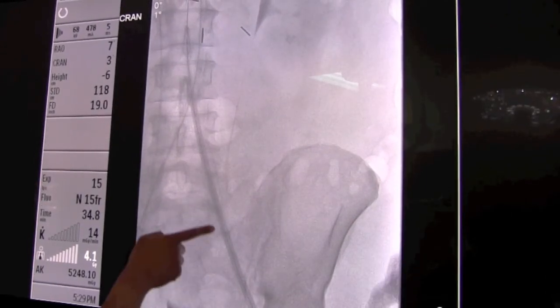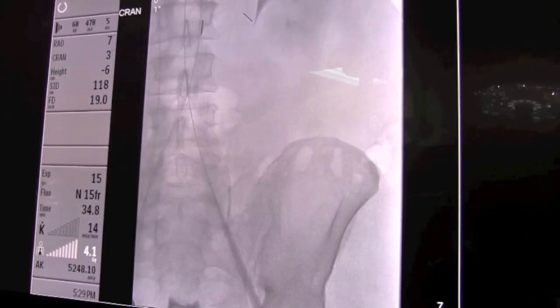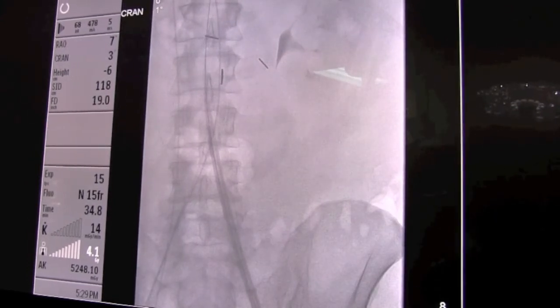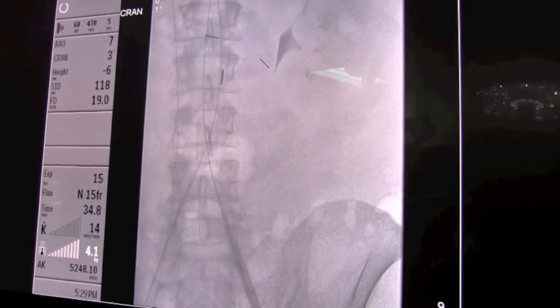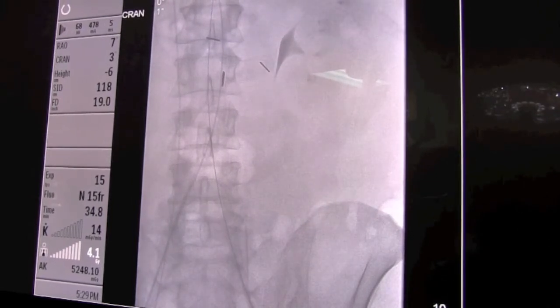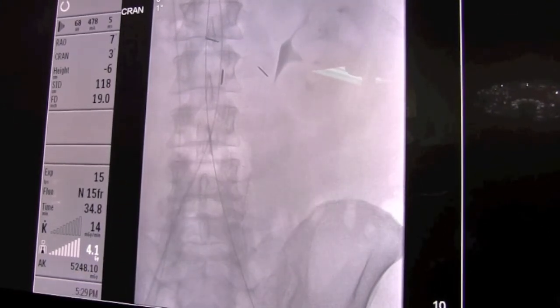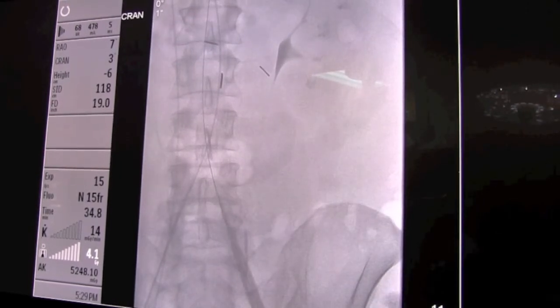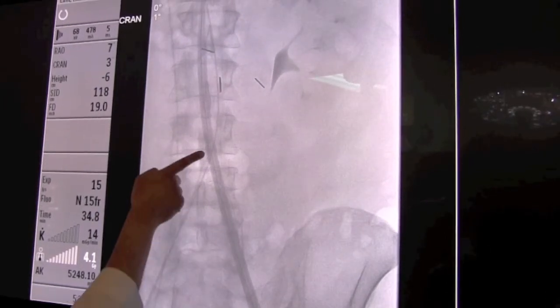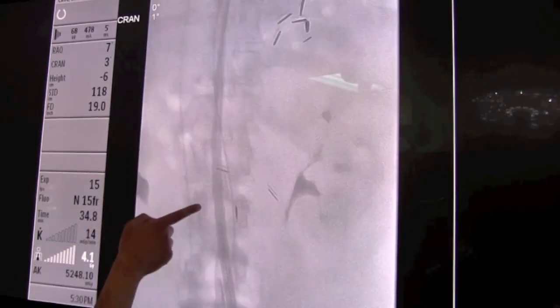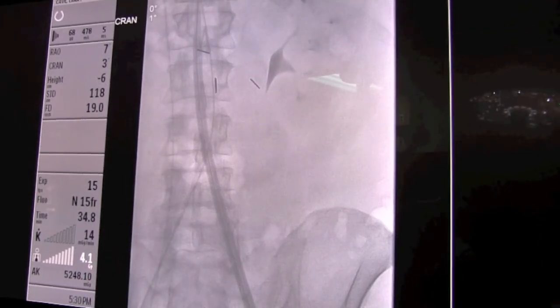Here are some pictures of the large dilators that we use to dilate the artery before we put in the large tube through which the valve will come. We progressively dilate — you can see these dilators going up, each a little bit larger than the previous one. That allows us to gently make this artery accept that big sheath. A larger dilator goes in, and then finally you can see the sheath going in with the dilator it's mounted on, and we position this sheath in the aorta to allow us to deliver the valve through it.